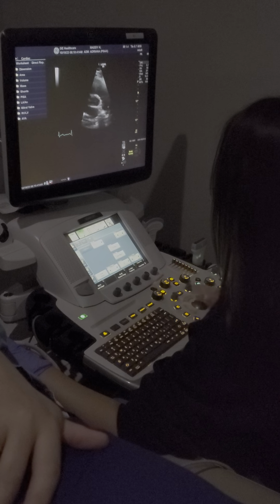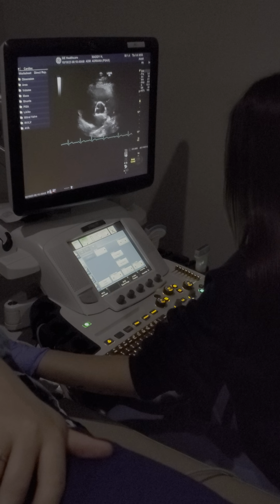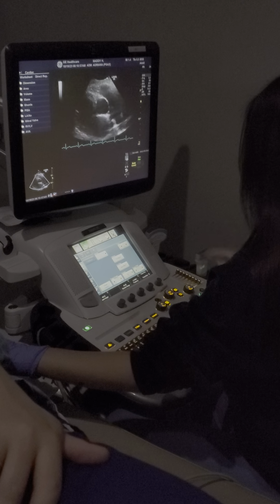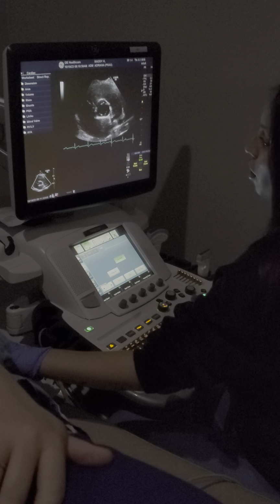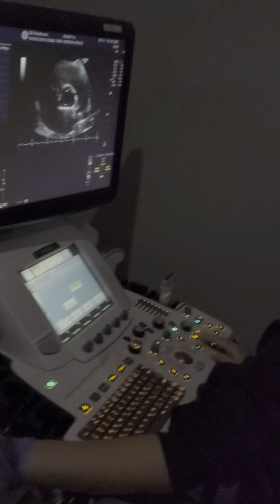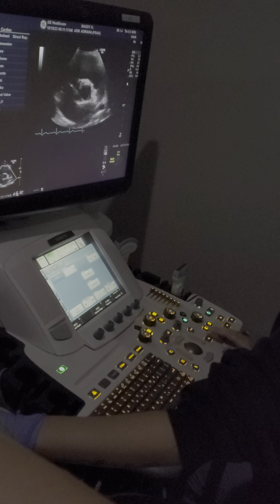Then you go back. I zoom my aorta. You guys can do whatever you want. It just helps me focus. So we'll zoom. There are 3 leaflets. Do you see them? Mm-hmm. I need to see all 3. 1, 2, 3. All 3 in the picture that you showed me of the aorta. Because people will have what's called bicuspid aortic valves, which means they only have 2 leaflets. So if you show me and there's only 2 leaflets, sorry, I'm going to think something is wrong with that person, right? So you need to be able to prove that there are 3 leaflets.